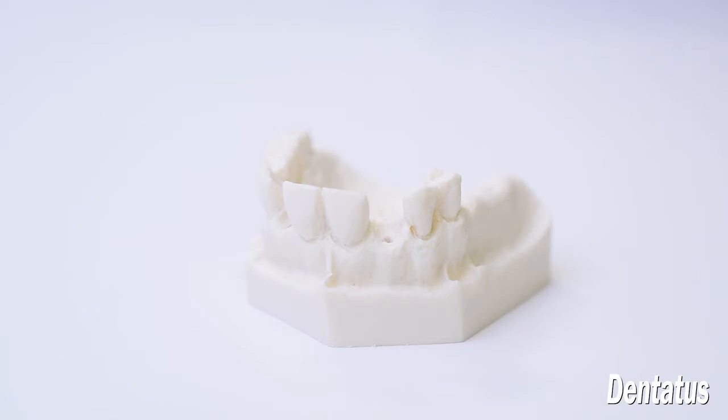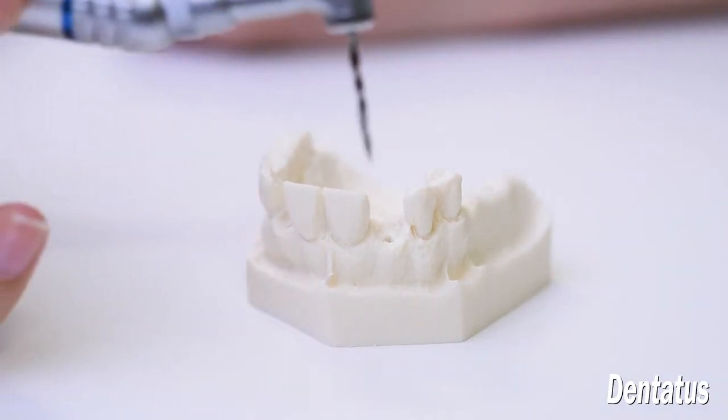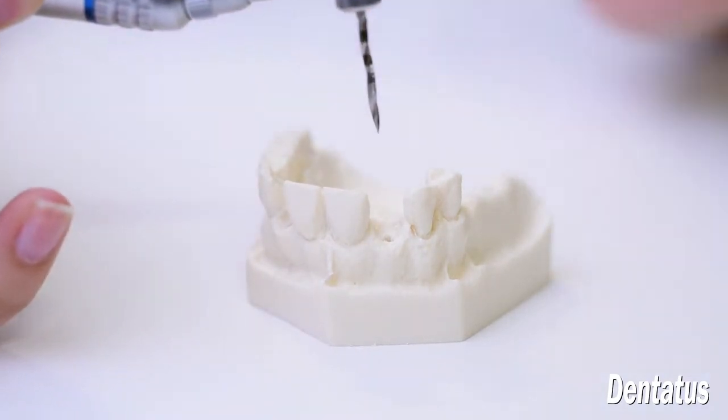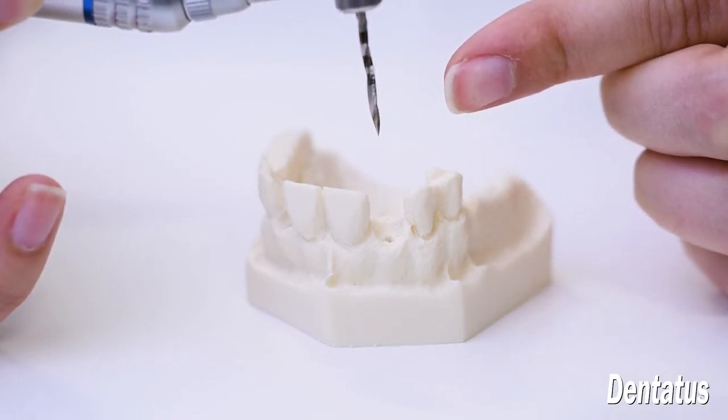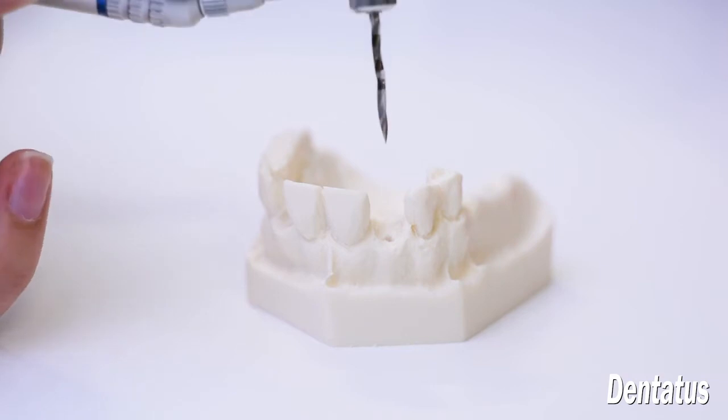Dentatus and new implants are frequently installed through the tissue without reflecting a flap. That's due in part to the design of the SEPO pilot drills. The ultra-sharp needlepoint tip eliminates chatter, assuring accuracy for position, angle, and depth.